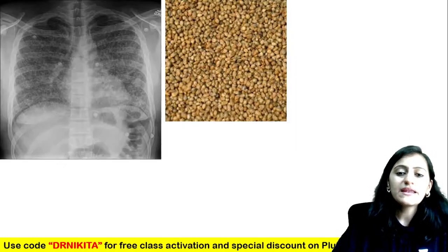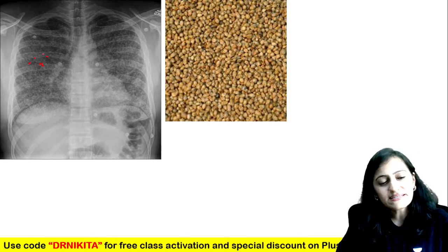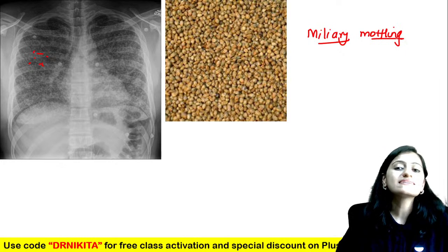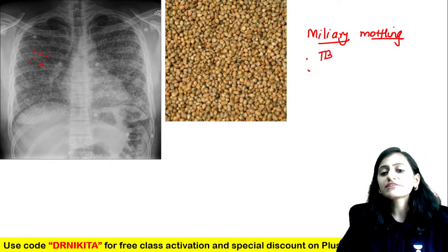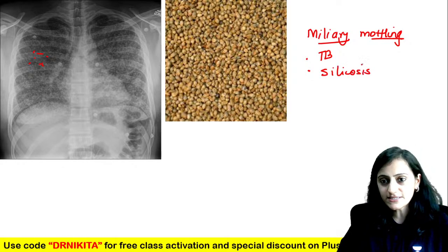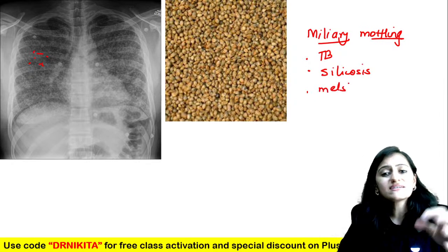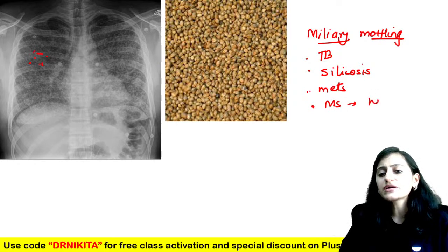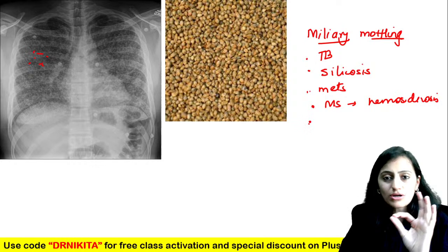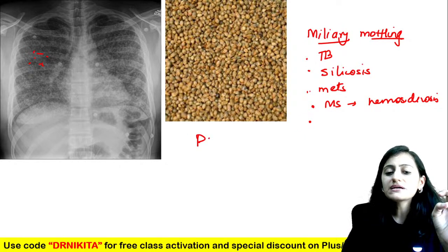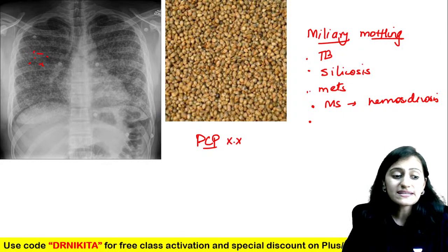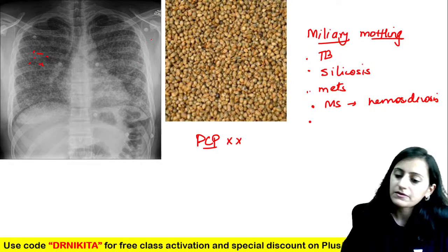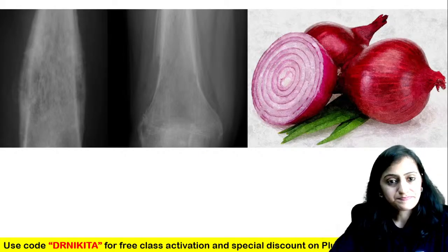These are the millet seeds — bilateral tiny tiny opacities in both lung fields — this is miliary mottling. Remember, not all miliary mottling is TB. Differentials include TB, occupational lung disease like silicosis, sarcoidosis, metastasis from thyroid, RCC, choriocarcinoma, and mitral stenosis leading to hemosiderosis. PCP pneumonia does not present with miliary mottling — it presents with bilateral perihilar ground glass opacity.